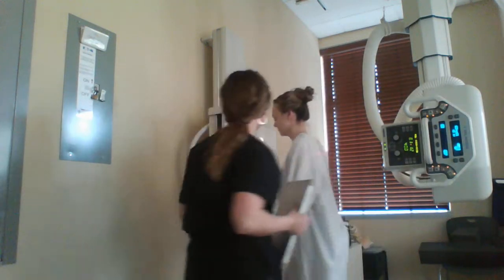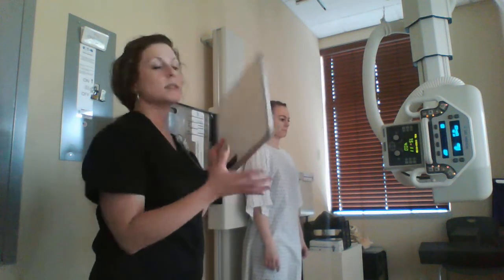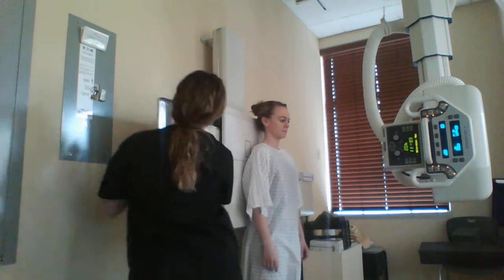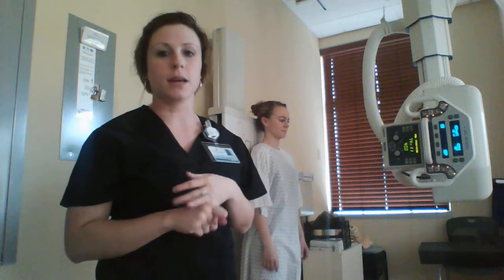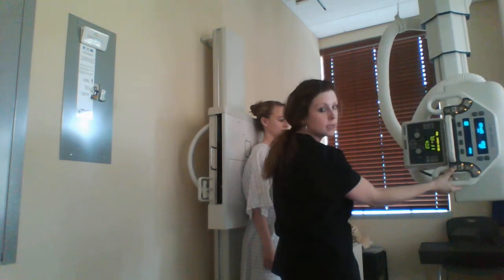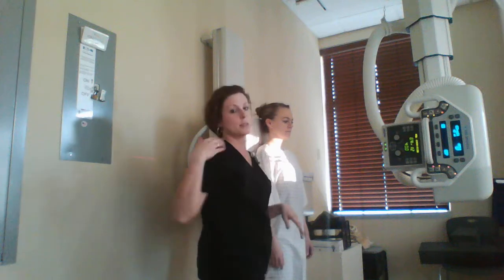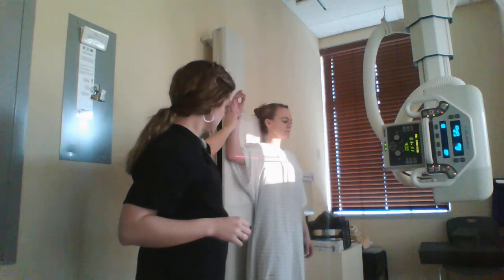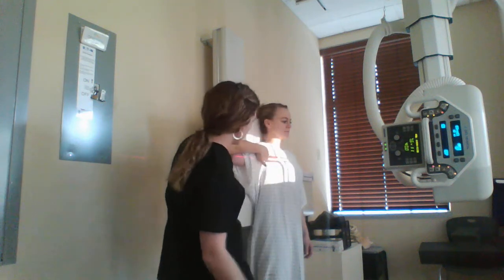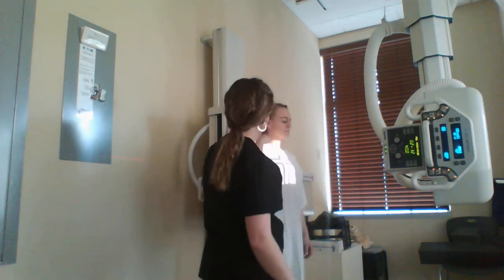So if you can just stand against the board for me. First we're going to do an AP scapula, and this is taken on a 10 by 12 cassette lengthwise. When doing an AP scapula, we will use an SID of 40 inches and it's 85 kVp at 11 mAs. Make sure this is detented. For an AP scapula, I'm going to have her scoot to the side because we're doing a right scapula, and bring her arm out at a 90 degree angle. You're going to find her coracoid — right about there — and go two inches below, then enter in the mid scapular area. You want to make sure you're getting the whole scapula in the image.